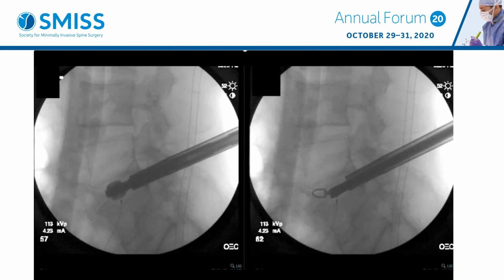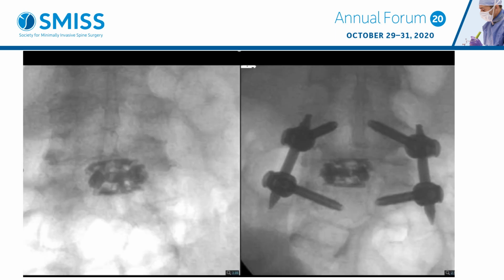There are specialized instruments for disc prep. On the left is an expandable paddle shaver. On the right is a curette. And I've placed on the left, you can see, the expandable titanium cage, and then placed the percutaneous screws using Marcaine. I do this as an outpatient procedure, so the patient goes home about an hour after the surgery.